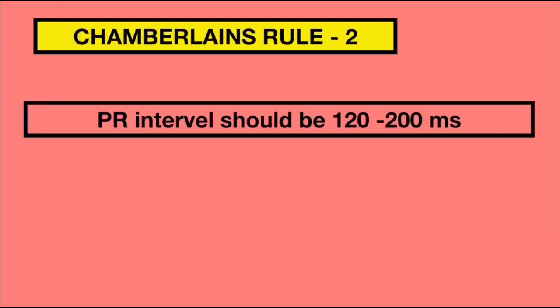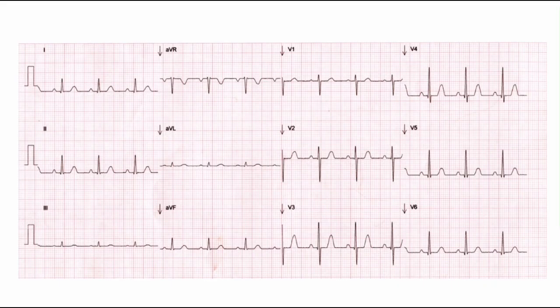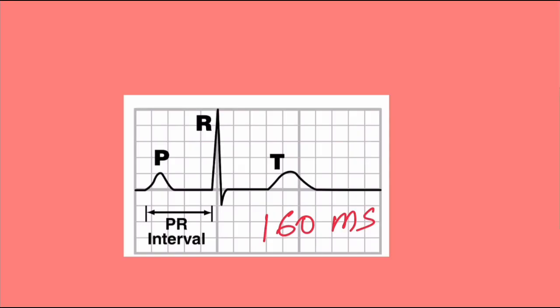Rule 2 states that the PR interval should be 120 to 200 ms, which corresponds to 3 to 5 small squares. In this ECG, we can see that the PR interval is 160 ms, that is 4 small squares.